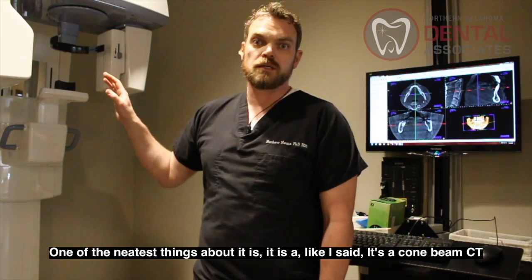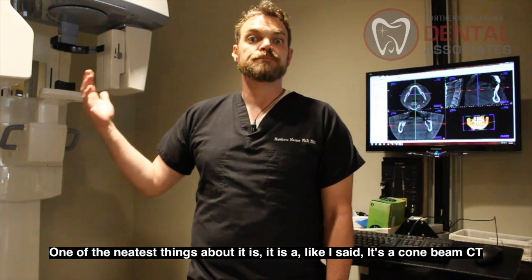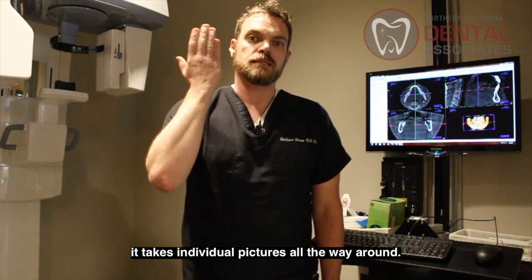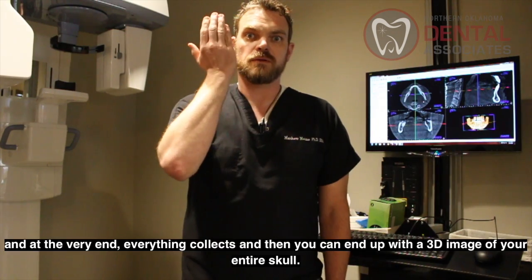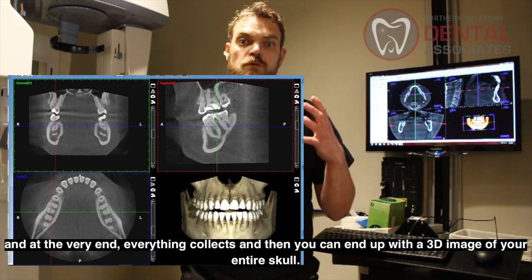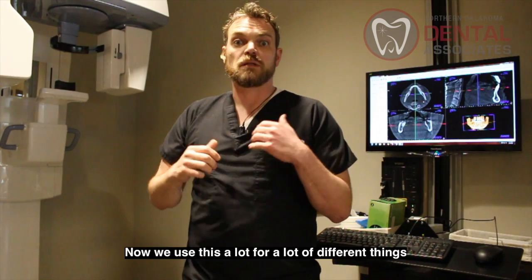But one of the neatest things about it is, like I said, it's a cone beam CT. So what that does is as this thing moves around your head, it takes individual pictures all the way around. And then at the very end, everything collects, and you can end up with a 3D image of your entire skull.